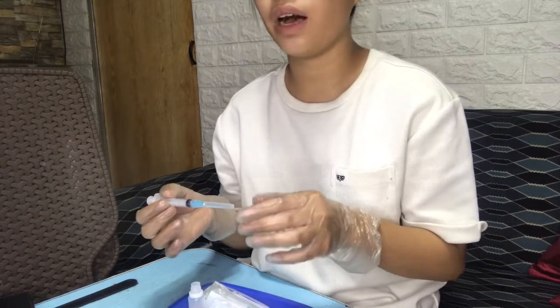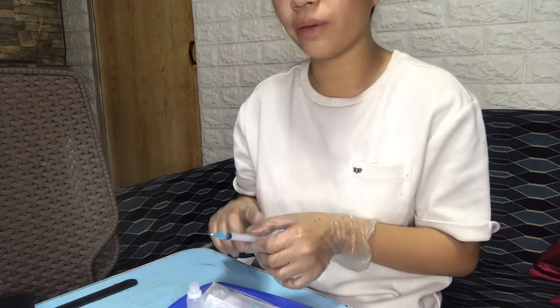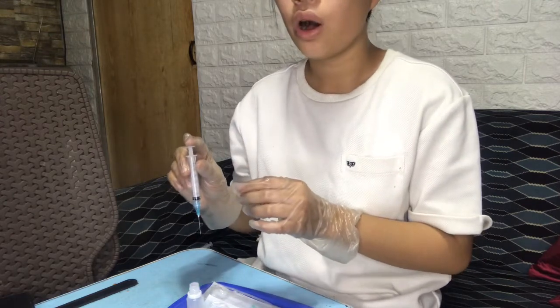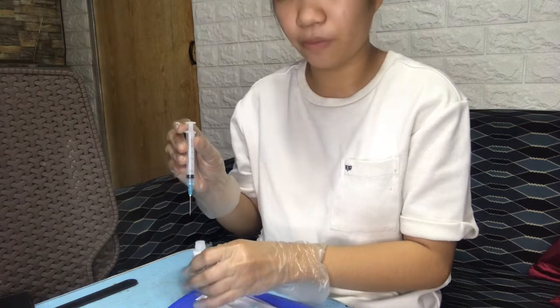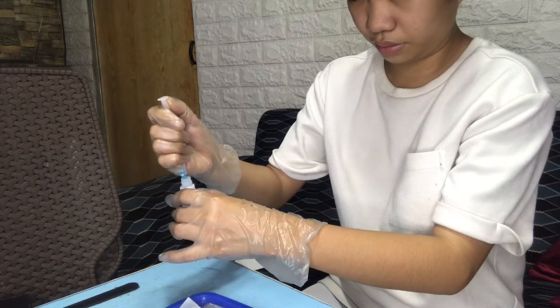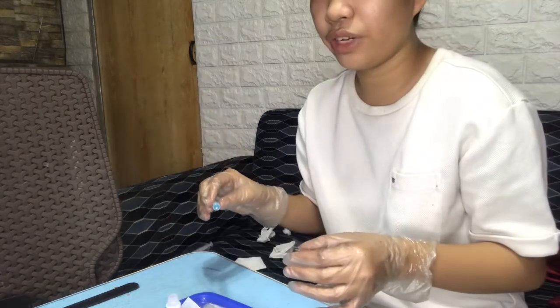After we attach the straw or the filter to the syringe, let's remove the cap from the filter needle and insert the needle into the center of the ampule. Do not touch the rim of the ampule with the needle tip or shaft. With a single ampule, hold it slightly on its side if necessary to obtain more than the ordered amount of medication. After that, if giving an injection, replace the filter needle.